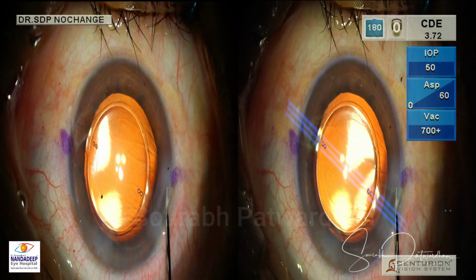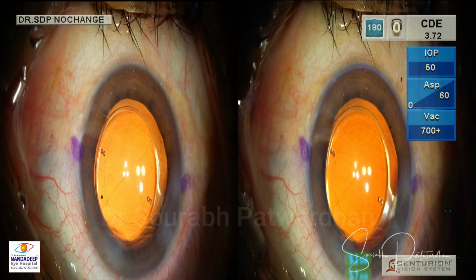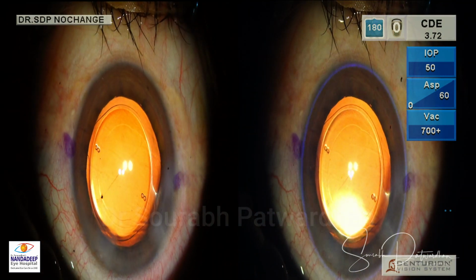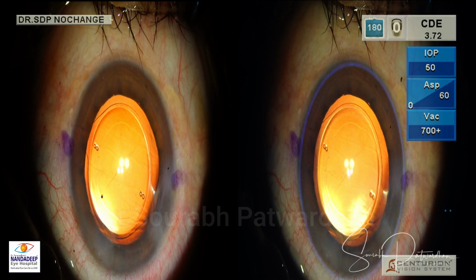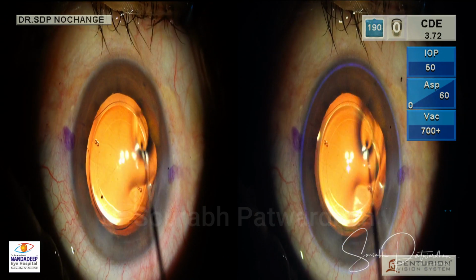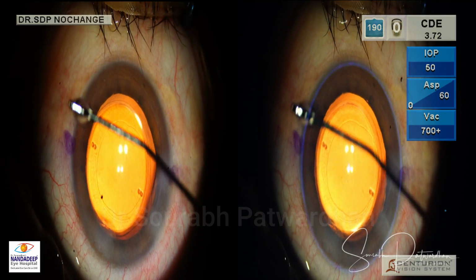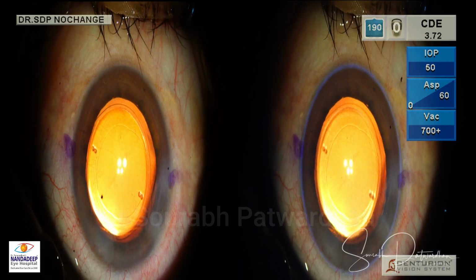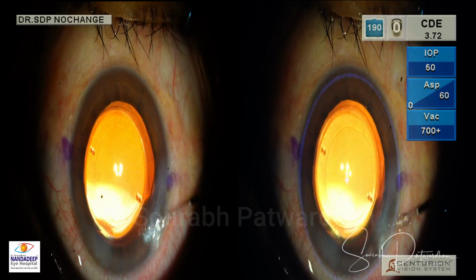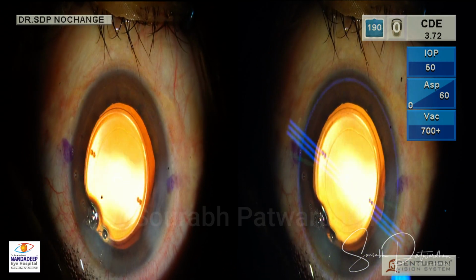Can you show the CCC of Callisto? CCC mark of Callisto. CCC, make it 5.8, please. It's not bright enough. See, you can see the CCC mark. So it's definitely more accurate. You can see the 5.8 is actually the size of the optic. Okay, so it's exactly showing what's the size of the optic. So you can use that guide also for accurate CCC sizing, also centration. In some cases we can center it around the visual axis, like when a high angle alpha is there. Yeah. Okay, now show the toric marks. Okay, it looks perfect.